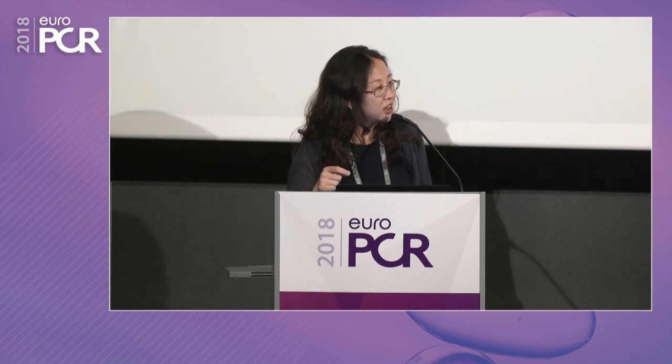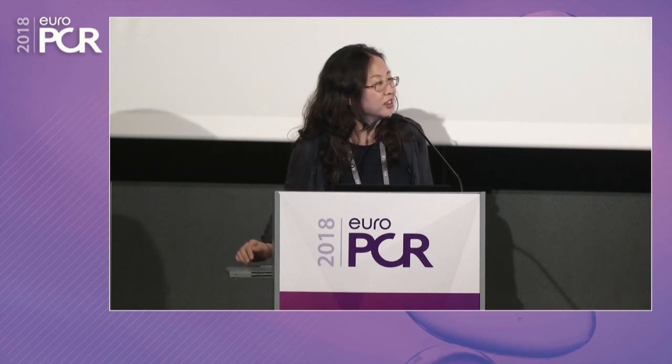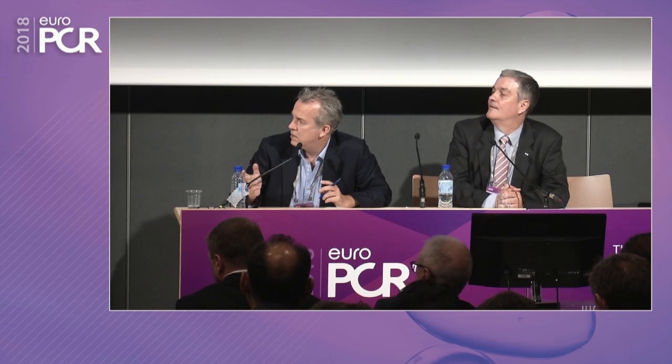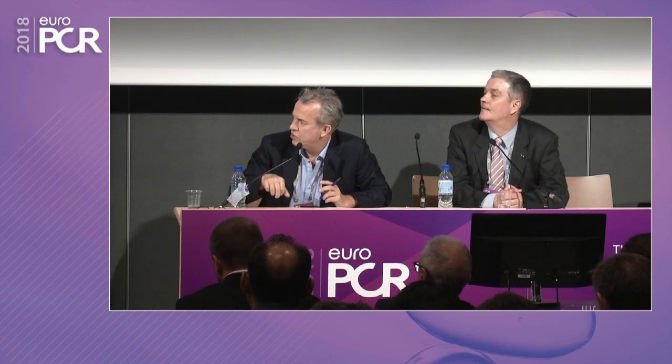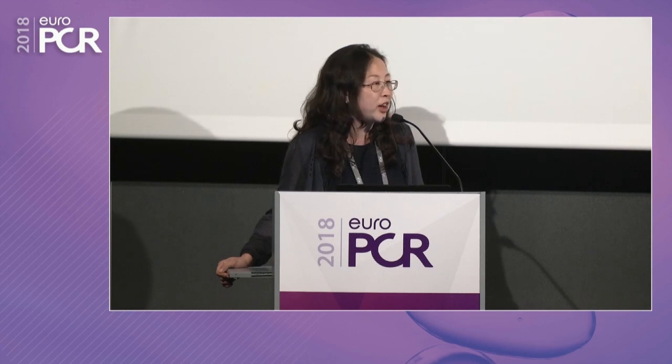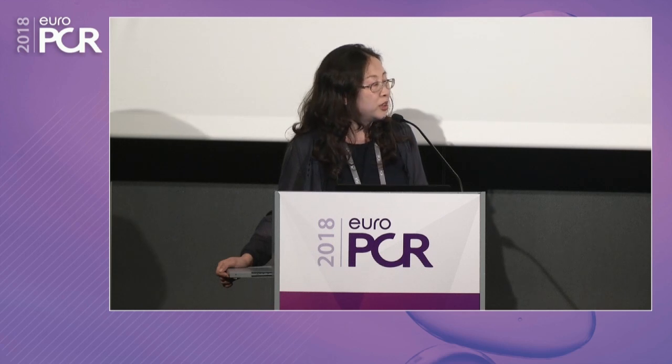The wire from the... Yeah, so that can be very easy to take out the wire. Yeah. And if I understood you correctly, you didn't approach this with a double kiss. No. And any particular reason for that? Not necessary for the mini crush, a nano crush that you did? Or you mean, nowadays we have very good DES, second generation DES, very well. And for this patient, I opened the side branch very well. So I don't think there is a need to do DK crush.